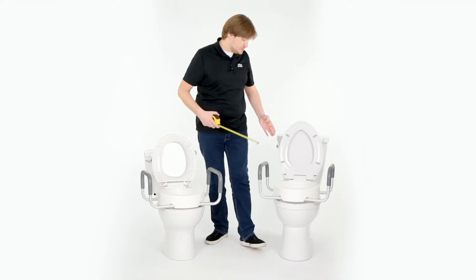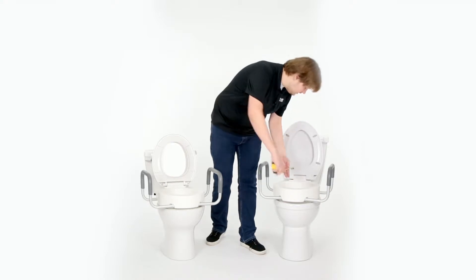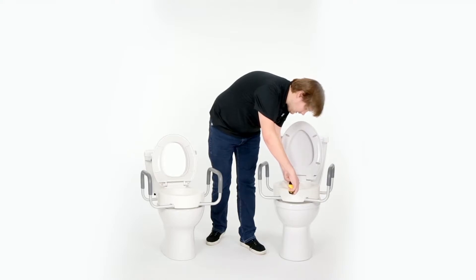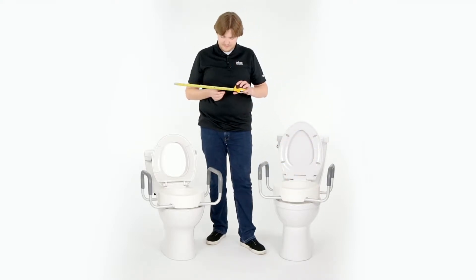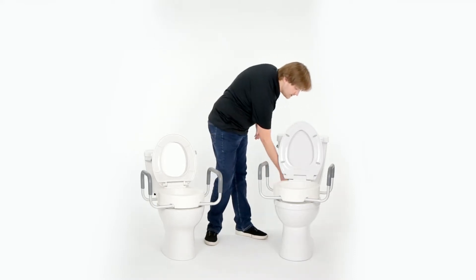On the elongated, you'll measure in the same spot, again, from the inside edge of the bowl, back to front. That's going to measure about 15 inches. That 3-inch difference is important when sizing out the riser.